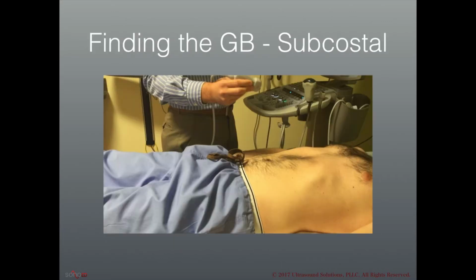I'm going to play a couple videos now about finding the gallbladder with ultrasound. There are several different approaches. Remember that this is a three-dimensional structure in a three-dimensional body, so you can find it from many different angles. But these are a couple common approaches, so I'm going to let this video play, and then I'll provide some comments.